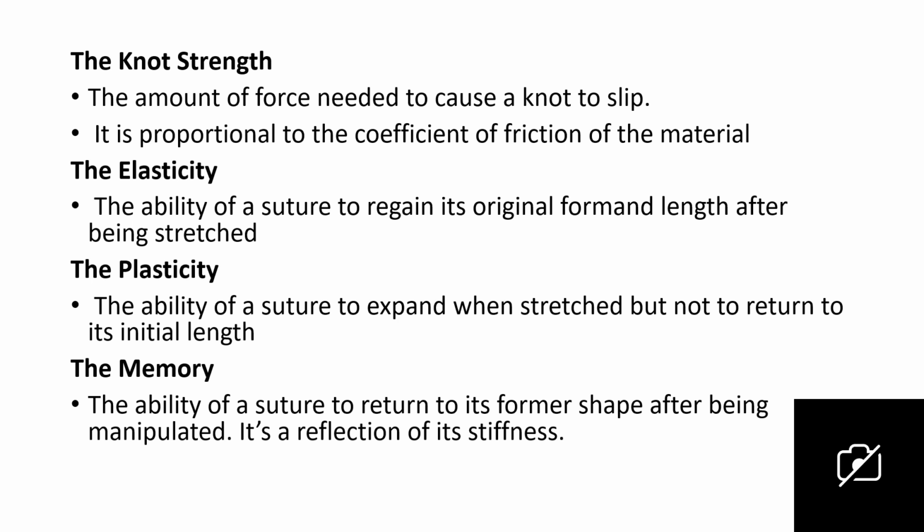The plasticity, the ability of the suture to expand when stretched, but not to return to its initial length. The memory of the suture, the ability of a suture to return to its former shape after being manipulated. It's the reflection of its stiffness. You know, when you're suturing, you're pulling the threads here and there, and if it cannot go back to its original size, or has plasticity, it's not a good suture.